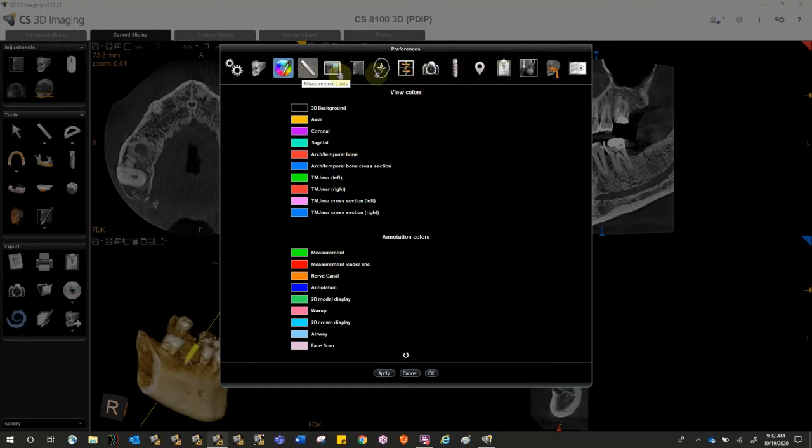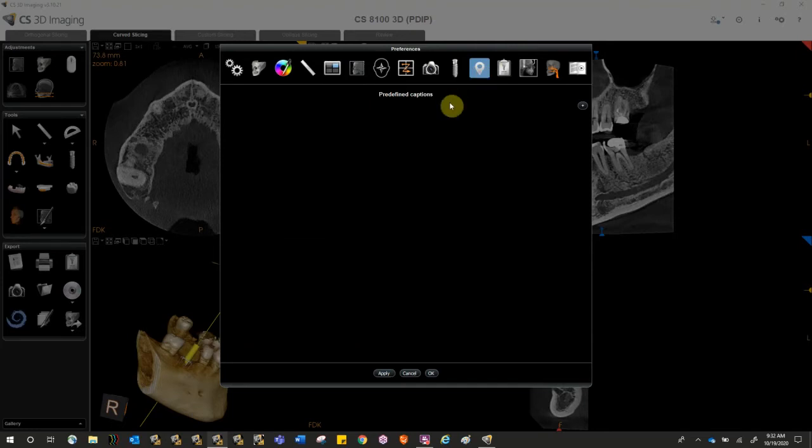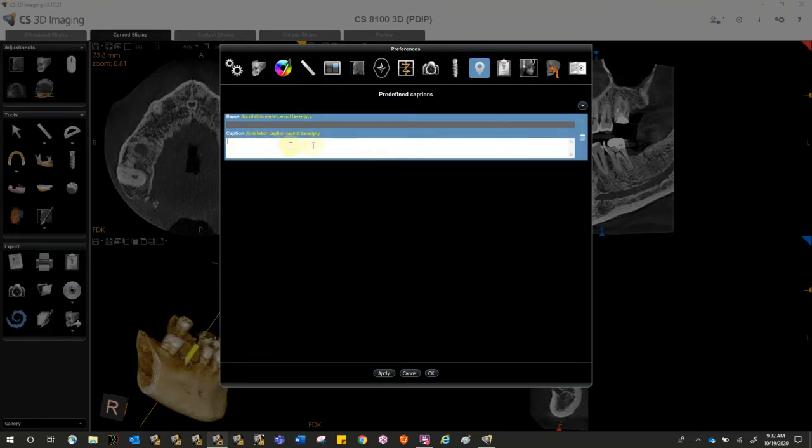And then if there's any captions that you're going to use all the time, like fractured cusp, foramen, anything like that, you can click this little plus sign right here and you can add those in. That way you can just select the annotation instead of having to write it out each time. Once you've made both of those changes, if you choose to, you can just click apply and OK.